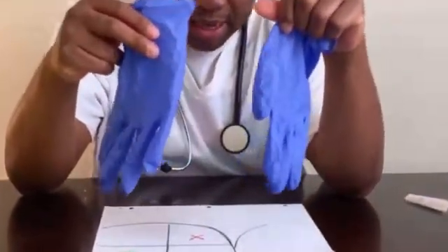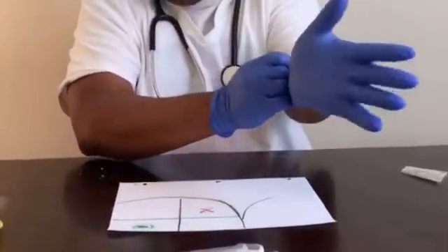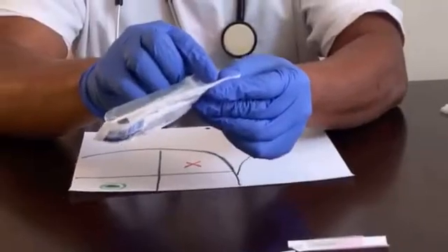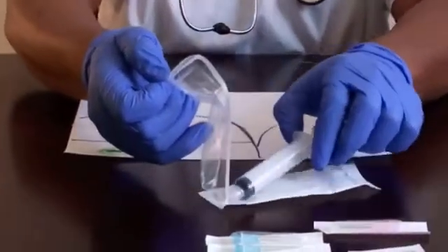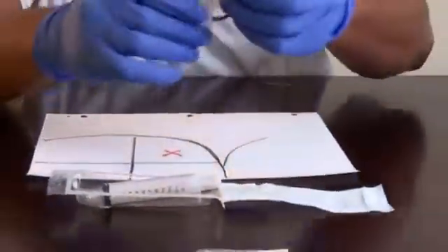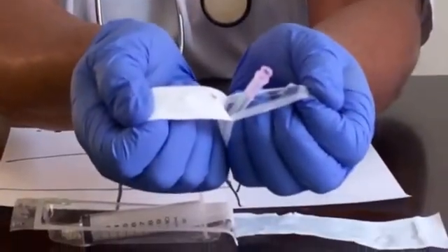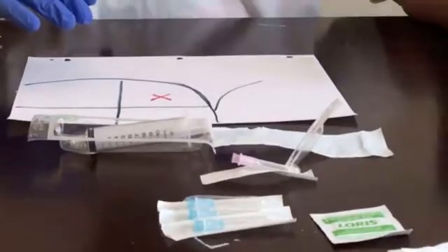Put on your gloves — they don't need to be sterile, just clean — to protect yourself and the patient. Open your syringe; here I have a 10cc. Open your needle in the same way and leave it inside its packaging for sterility. Your medication is here ready to use.